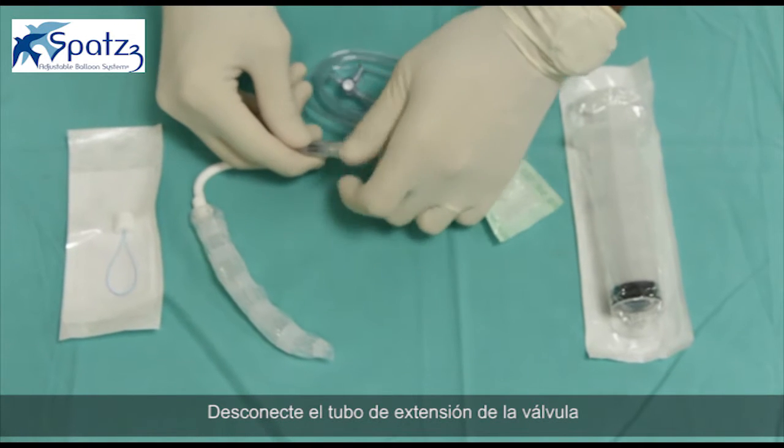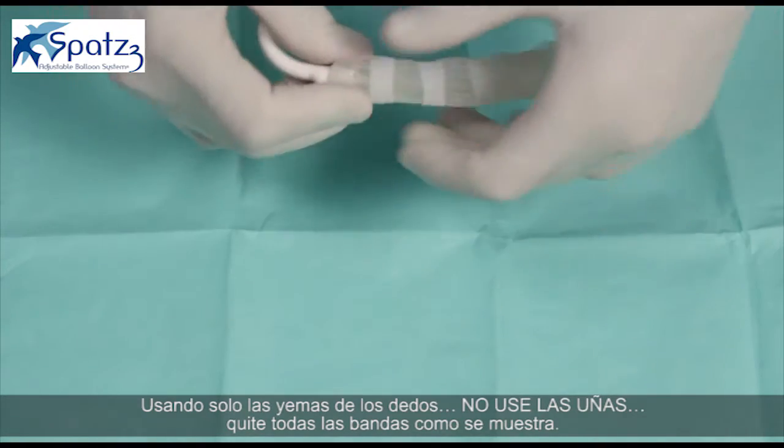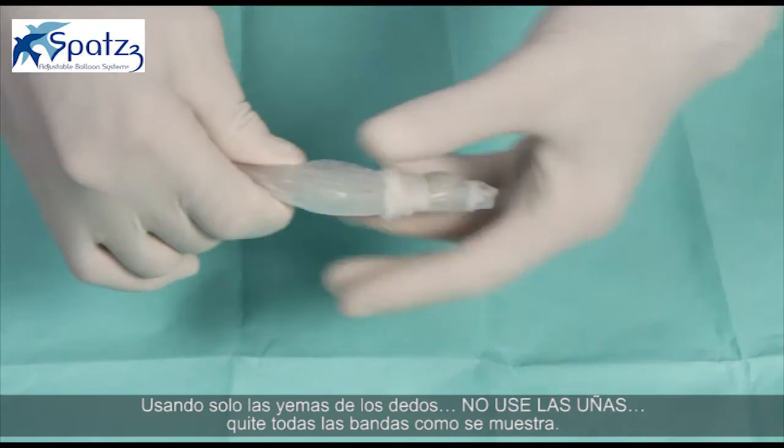Disconnect the extension tube from the valve. Using finger pads only, do not use your nails, roll off all of the bands as shown.